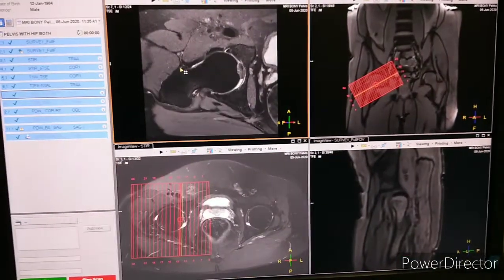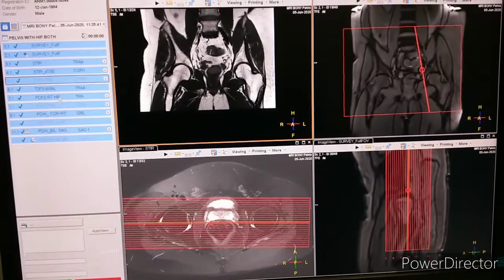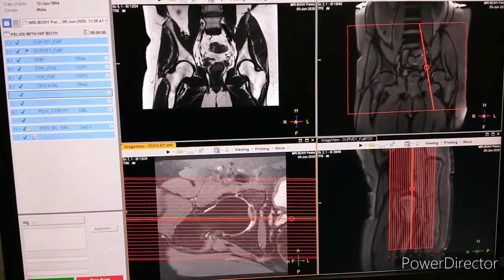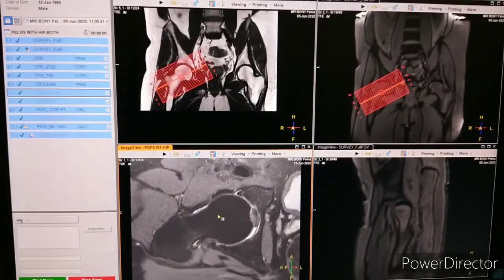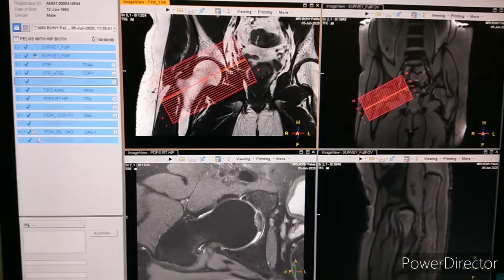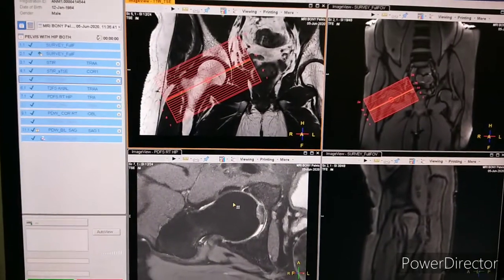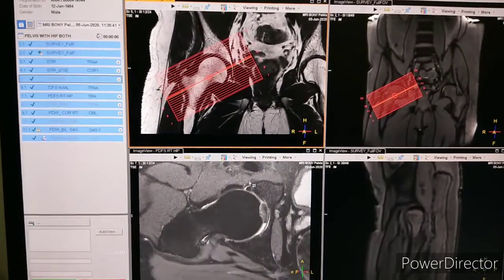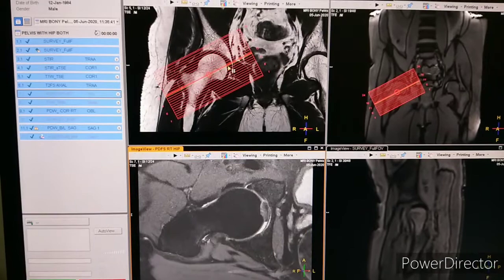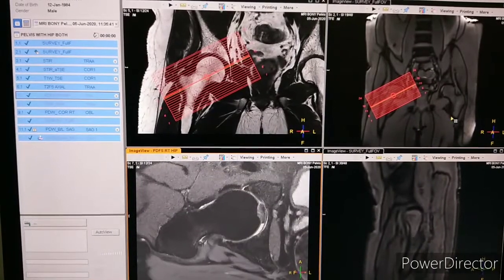The next main sequence is PDFS oblique axial. We have targeted the right hip because the patient has pain on the right hip. We have acquired oblique axial according to the neck of femur. You can see the planning.